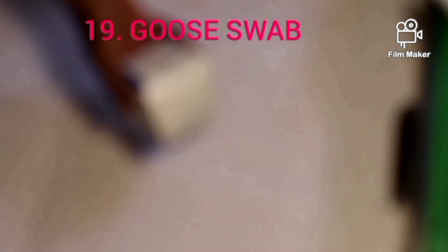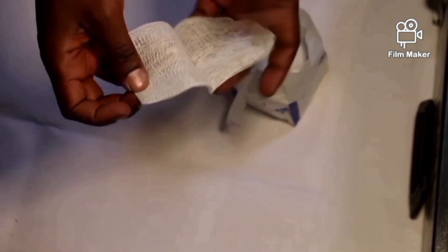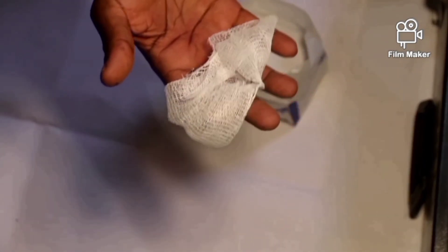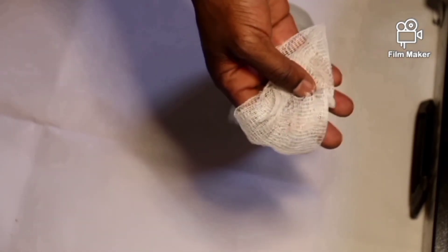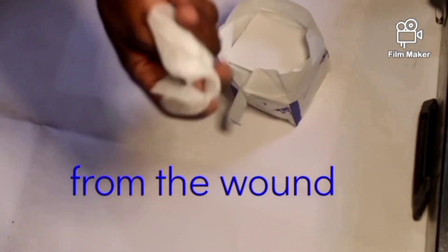This is a packet of gauze swab. This is what is found inside — this is one of them. This is called gauze swab. It comes in a quantity of one packet. This is the material used to clean and wipe around and away from the wound.